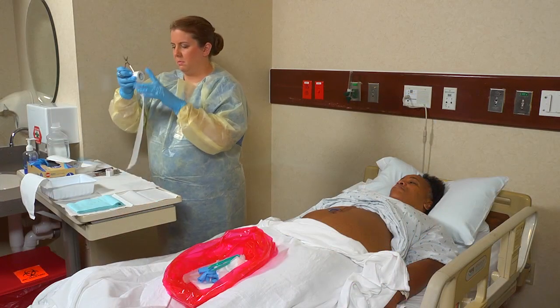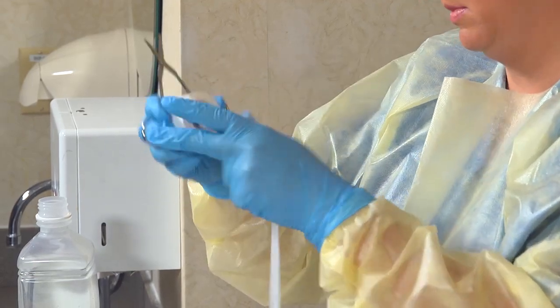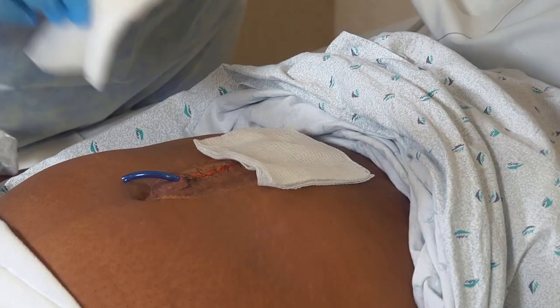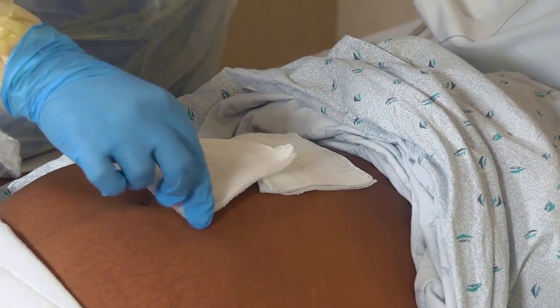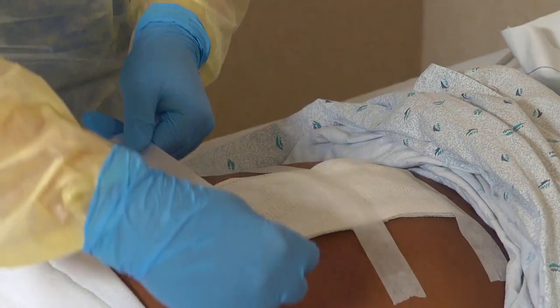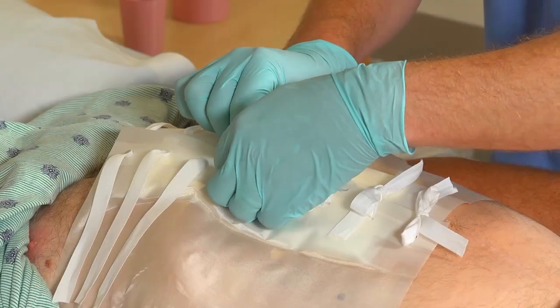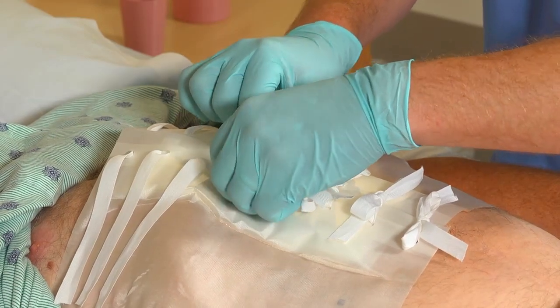Cut the lengths of tape that you'll need. Next, apply dressings as directed by the nurse and tape the dressings in place. Or, secure them with Montgomery ties.